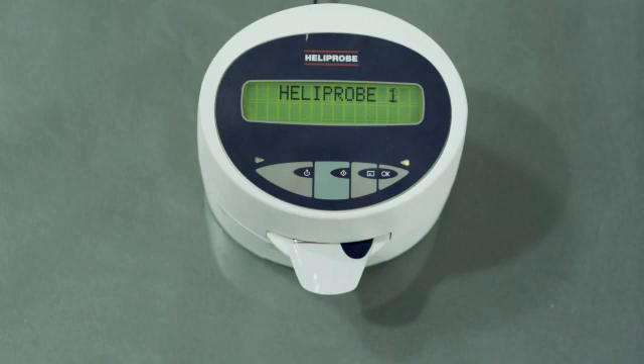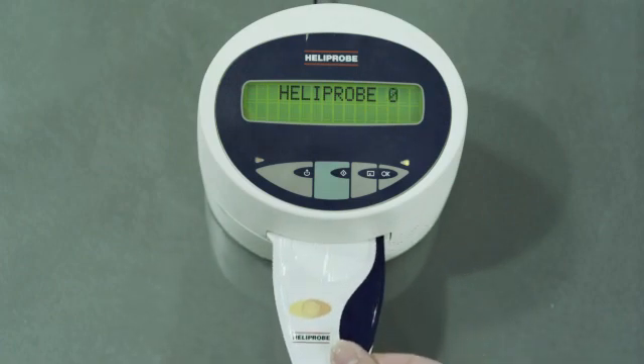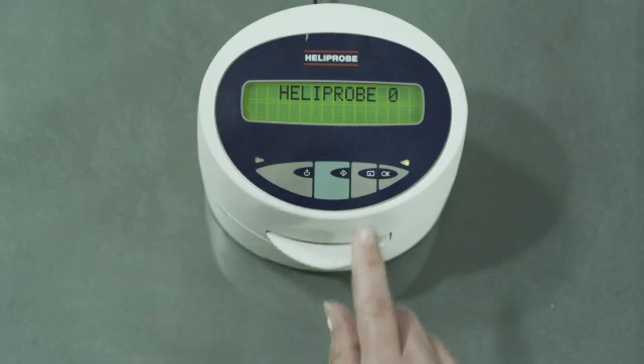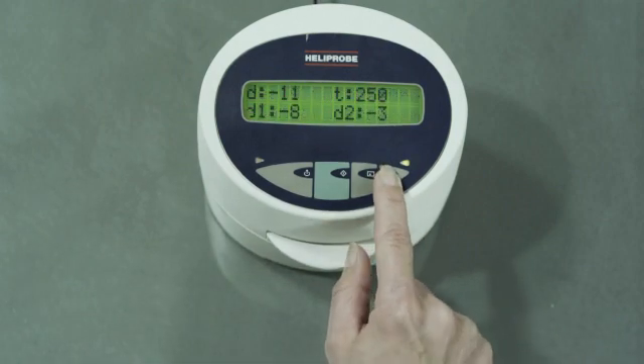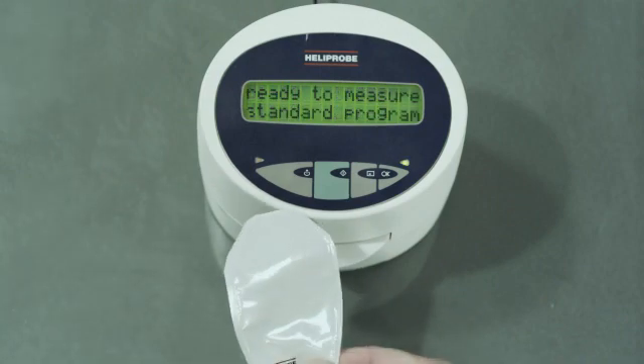In case of a borderline result, the system will automatically reanalyze your test twice. Remove the breath card. If you want to see the counts, press OK twice. Then insert the protection card.